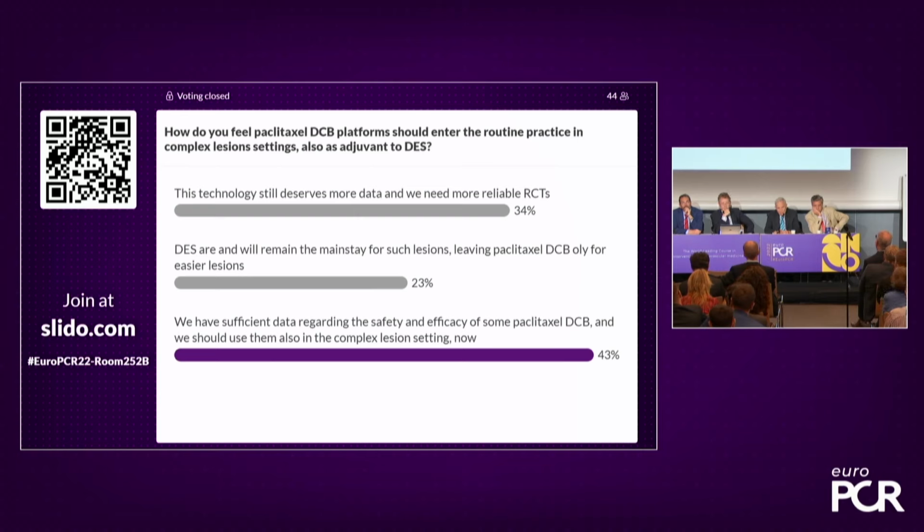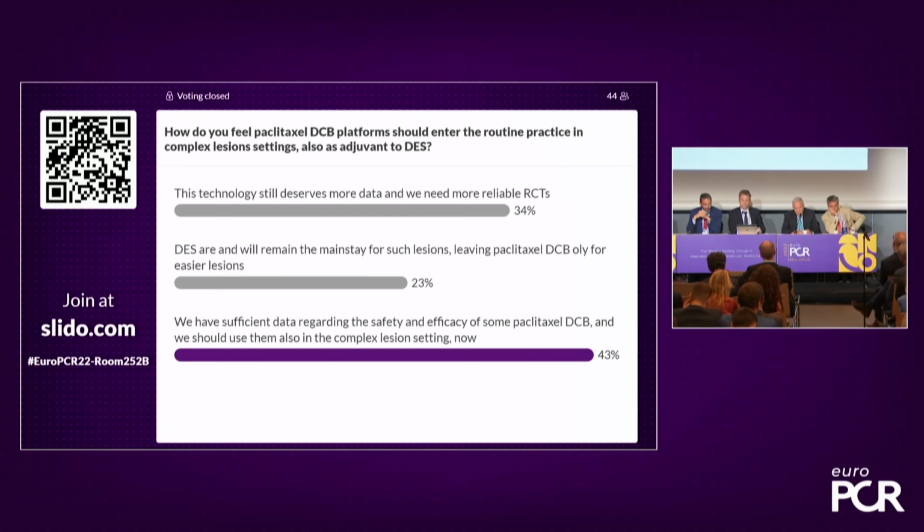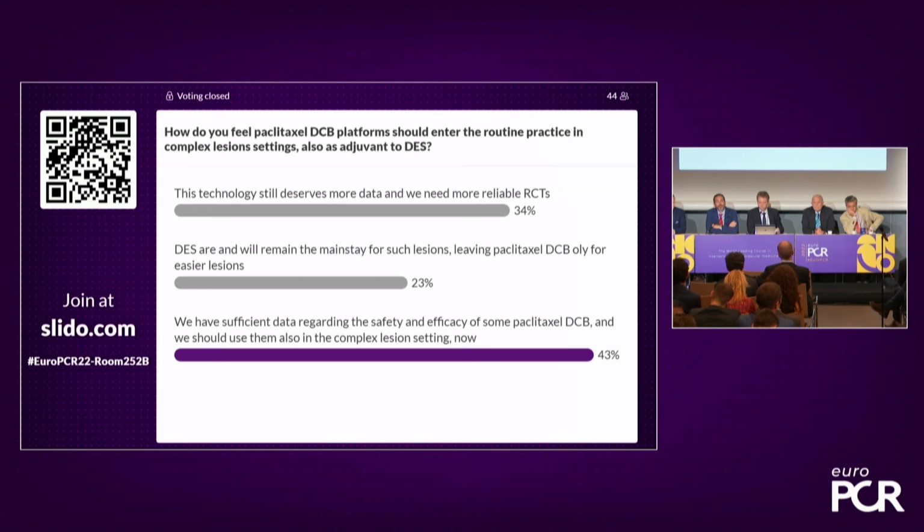The cases that we saw today, one of them that you showed where you had excellent results in an LAD that was calcified, diffuse LAD, we don't usually see that with balloons. Normally we see dissections, you wait your 8-10 minutes, sometimes you wait 15 minutes, and then you're worried that at night you're going to get called with an acute closure of an LAD. So that's going to be really the dividing point here. Otherwise, you dissect and you put your drug-coated balloon. So that is a concern.